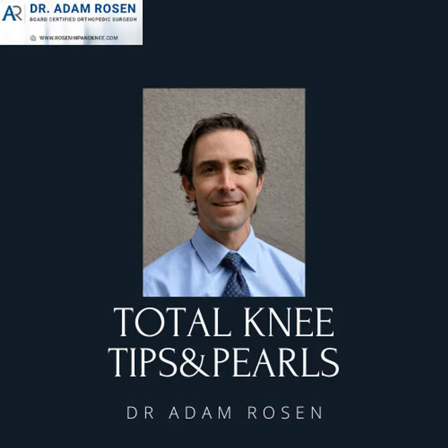So for sake of simplicity, let's say they have just a primary total knee that you're now revising, say 15 years down the road, due to polyethylene wear and osteolysis with potential loosening, and we're taking out implants. So for me, anytime that I do a revision, as long as the skin and soft tissue envelope will allow it, I excise my old scar. I always want to have healthy tissue healing to healthy tissue.